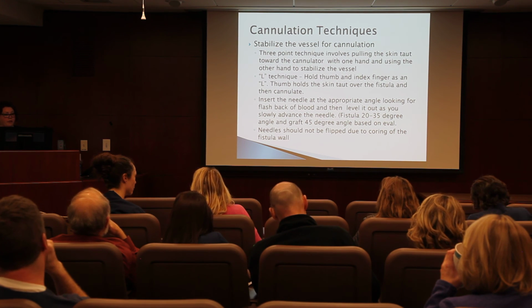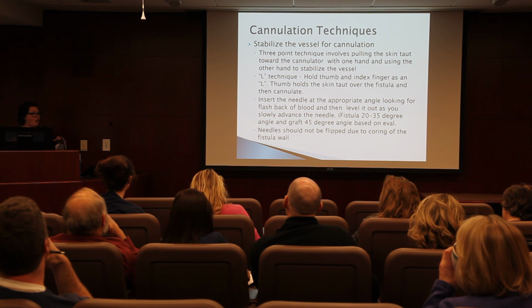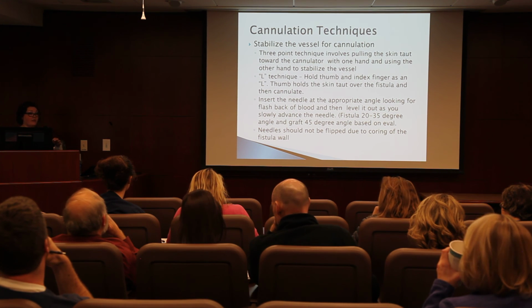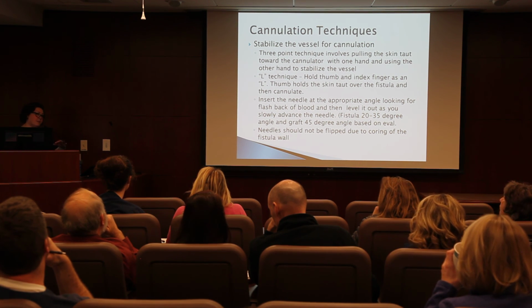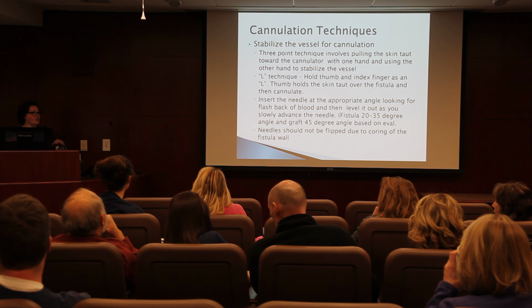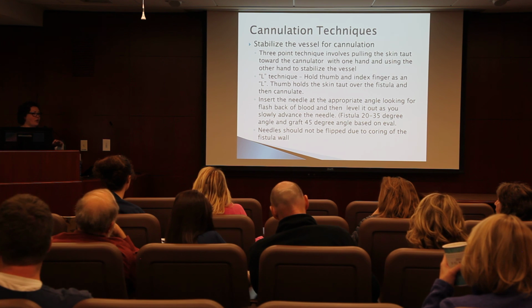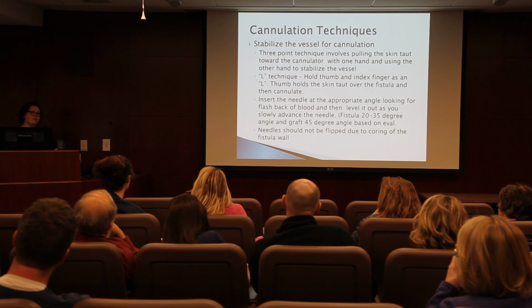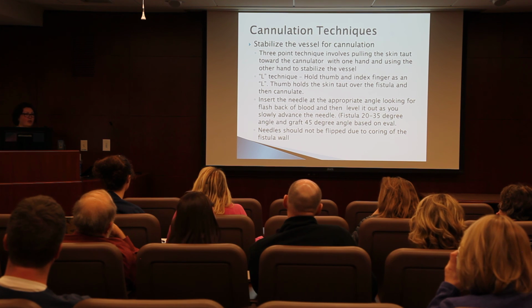So that was kind of jumping ahead, but after you get the needle in, some of the nurses will go in a little ways and then pull back on the syringe to see if they're in the vessel. Once you get that flashback, then you can advance the needle. Some people are expert at it, and they know when they're in, and they just go ahead and insert it, and then they'll pull back to make sure. It's all up to you if you want to go slow and pull back a little bit each time, just to make sure when you actually get into that vessel. It's all different. Any questions on that?